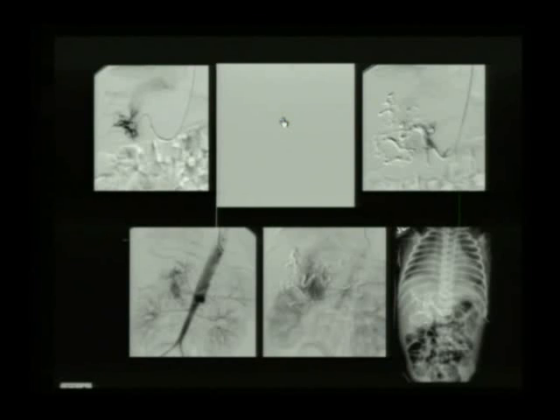These are extremely, extremely rare conditions, and most pediatric interventional radiologists may deal with one, perhaps, in their work. But what we decided to do was to try and get the glue into some more of the central circulation, so into the equivalent of the nidus. You must always do these things coaxially. There's no reason to not do that.